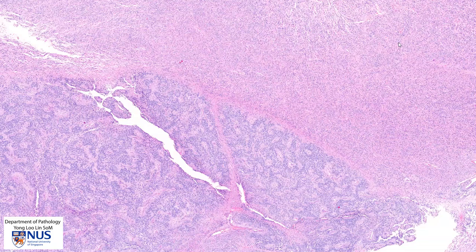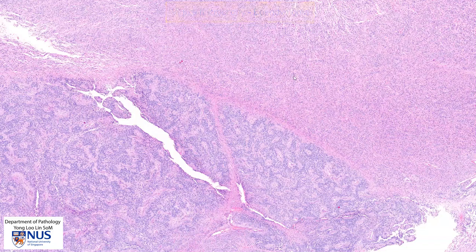Hello, this is a virtual microscopy slide taken from an ependymoma in the cerebellum in a four year old child. Looking at relatively low magnification, we can see that the tumor appears to have two different looking areas. On the top right is a slightly pinker area and on the bottom left we have this very interesting bluer area with a kind of intriguing repetitive pattern.